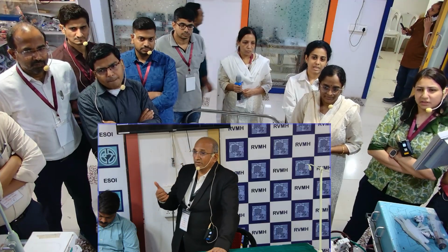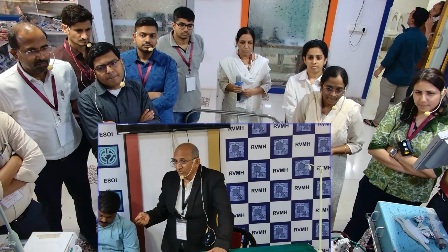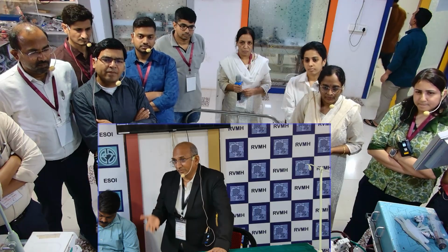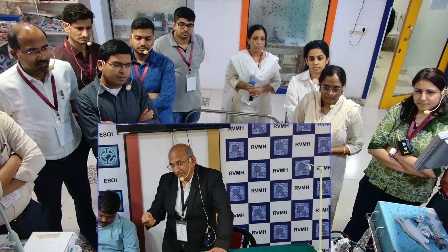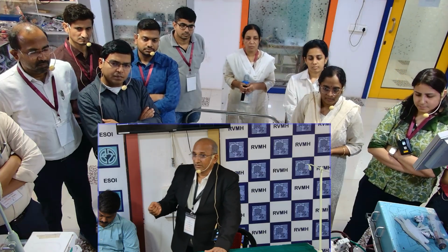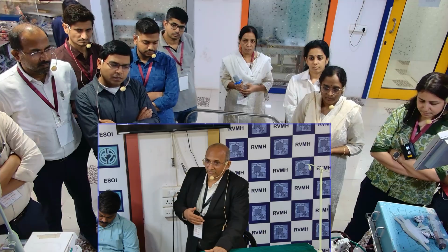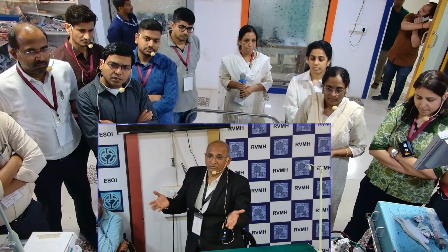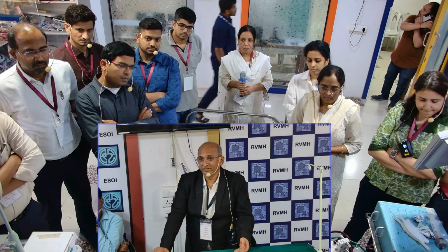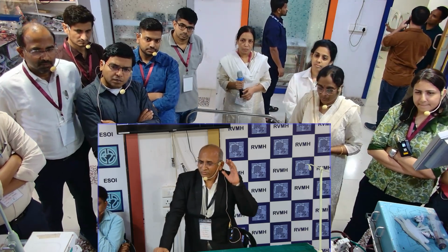And the HME filter. So there can be a filter block, there can be a tubing leak. If there is some crack in the tube, it keeps on leaking, that can happen. It can be a disconnection, as simple as that. Somebody by mistake pulled the tube out, or it has come out by itself, not connected properly. So these are the differential diagnoses of sweep gas failure, isn't it? So when you have a telltale sign, you have to just trace and follow it.